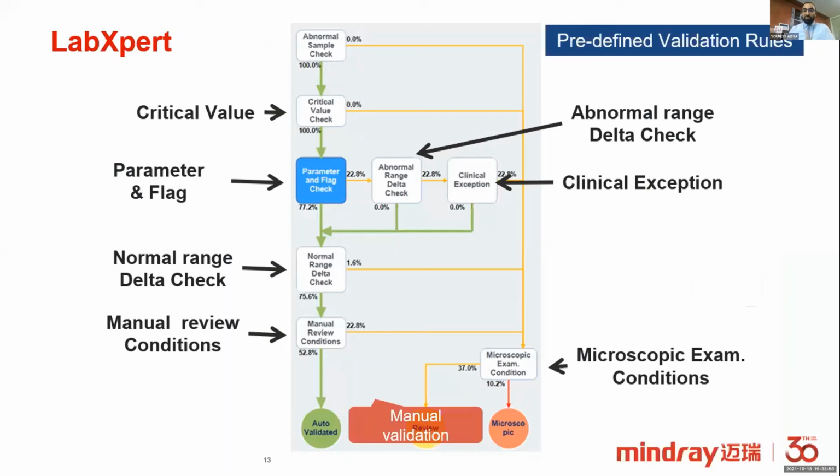software. By default it comes with the BC 6000 machine, all BC 6000 and above analyzers. We have this Lab Expert.